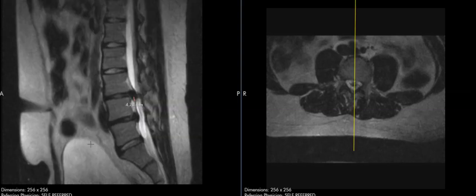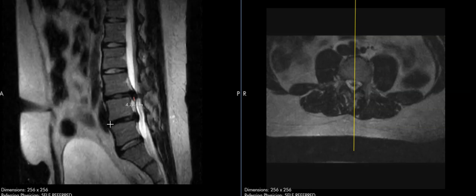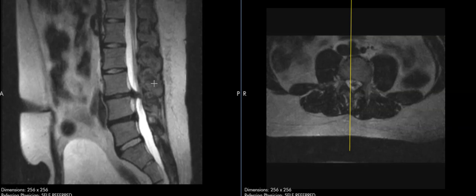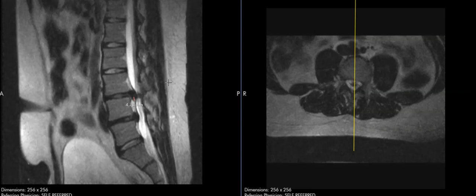And we also notice in this patient that their bladder is large. It comes up here pretty high. Here's their belly button. Apparently they had gone to the bathroom right before the scan and they emptied their bladder, but the bladder is still significantly distended. So this may be related to compression of those nerves. It can lead in bad cases to bladder or bowel dysfunction. And so this is something they're going to follow up with their doctor right away and to try to get some advice from their neurosurgeon.